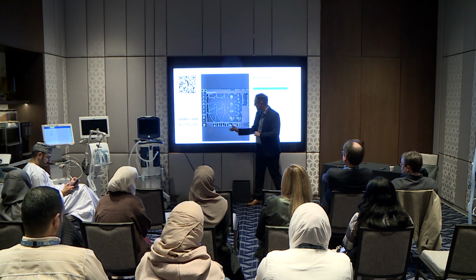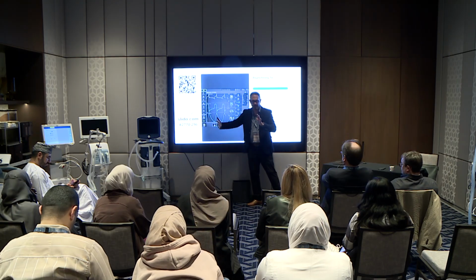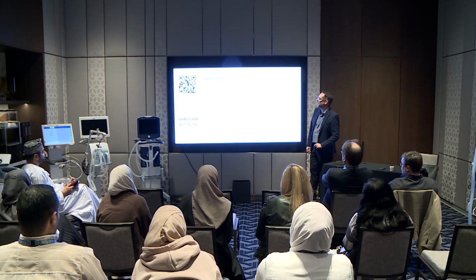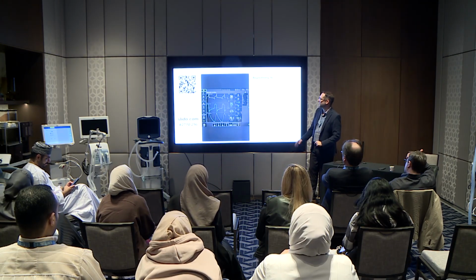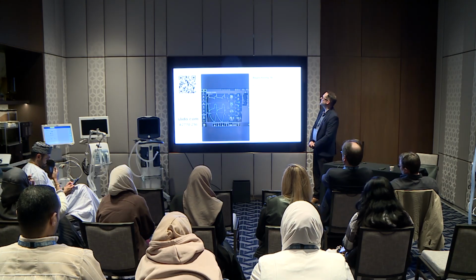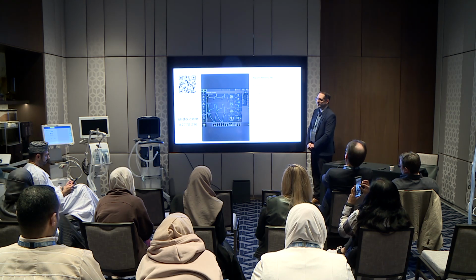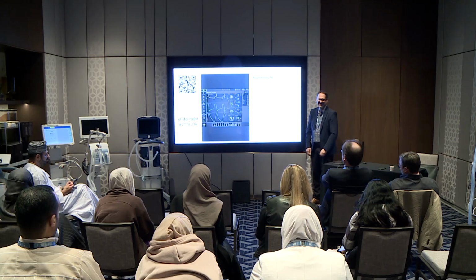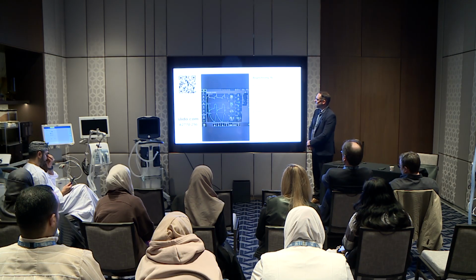Over assistance would be late cycling. So you're assisting for too long a time. Okay, so then this should be a very quick one because there's no option about under assisting. So what asynchrony do you see here? We just discussed it, so this should be a very quick vote. Notice how early cycling is not even an option, so that's why I didn't want to go next, because it wasn't an option.